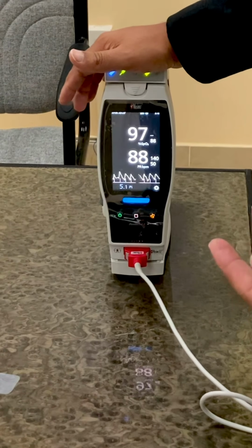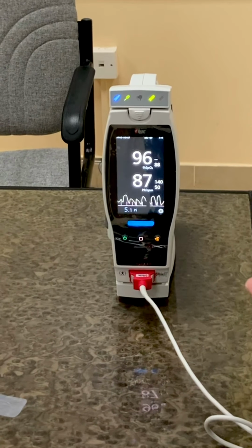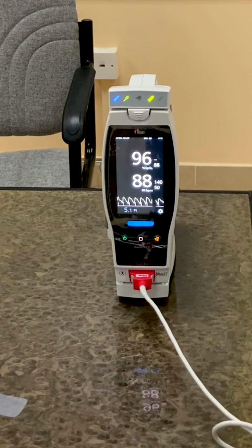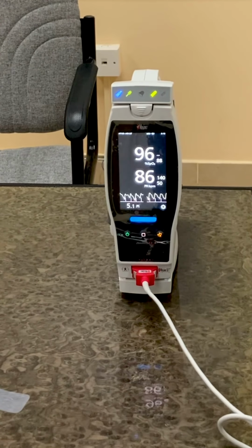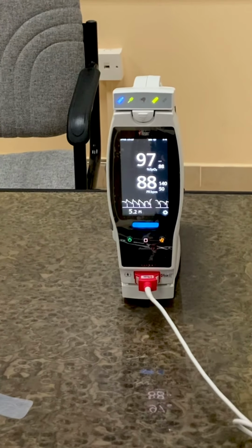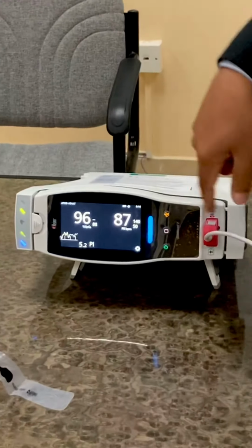But sometimes we will not get any value, especially for neonatals. At that time you need to check the hand, or wherever you are applying it. For babies, maybe we are connecting it on the leg, right? Sometimes, yeah. But you don't have any NICUs here? Yeah, we have. They are having this one. Okay, so we are done with the connections, and the result is here. If you want to make it the other side, it will automatically align.